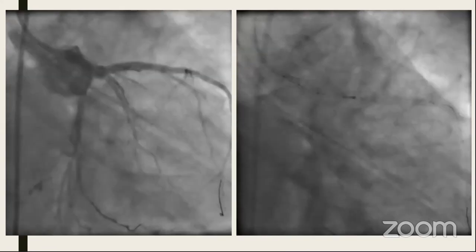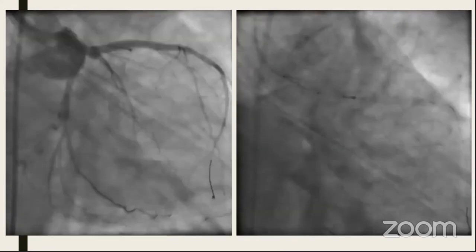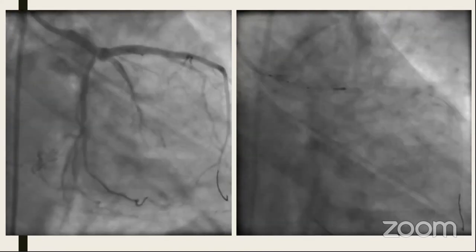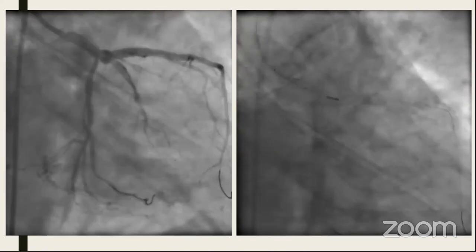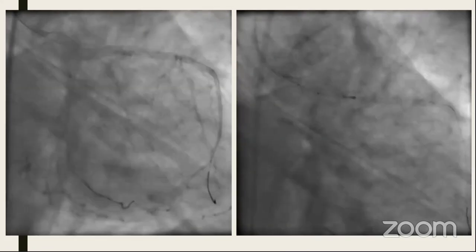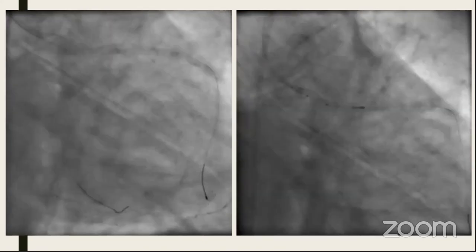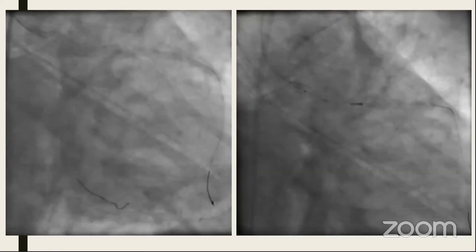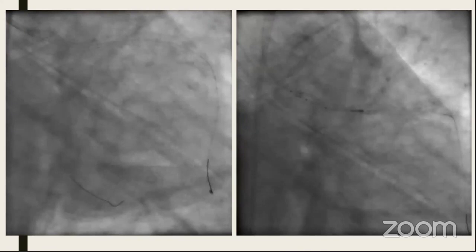But alhamdulillah, and with thankfulness and gratefulness, the small side branches that were coming from the proximal part of the aneurysm, related either to the aneurysm or to the left main, were still intact. The aneurysm size generally became a little bit smaller than what it was, and possibly this is because of relieving the obstruction distal to the aneurysm, reducing the pressure inside.